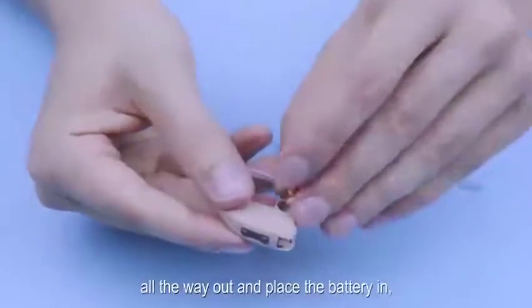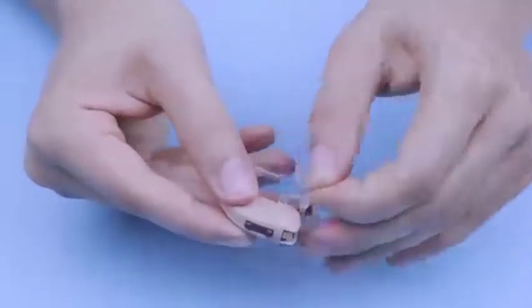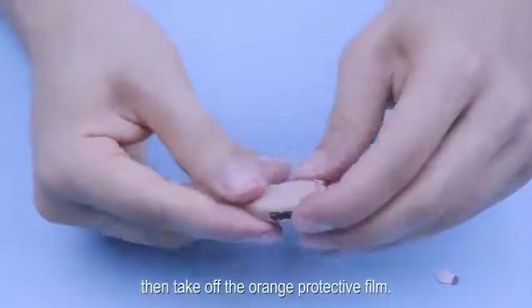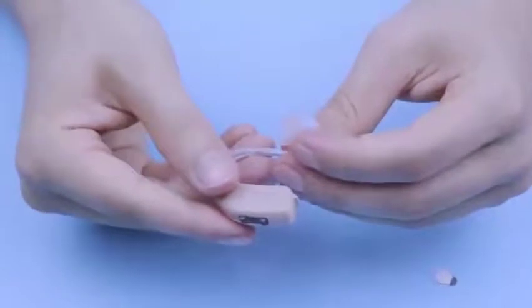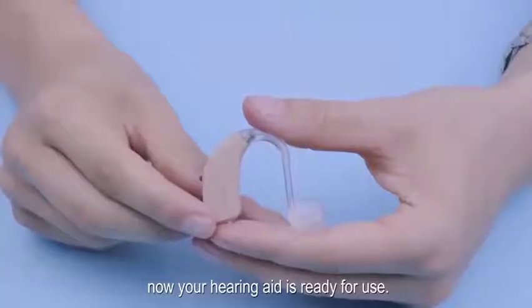Next, open the battery door all the way out and place the battery in. Then take off the orange protective film. After closing the battery door, your hearing aid is ready for use.